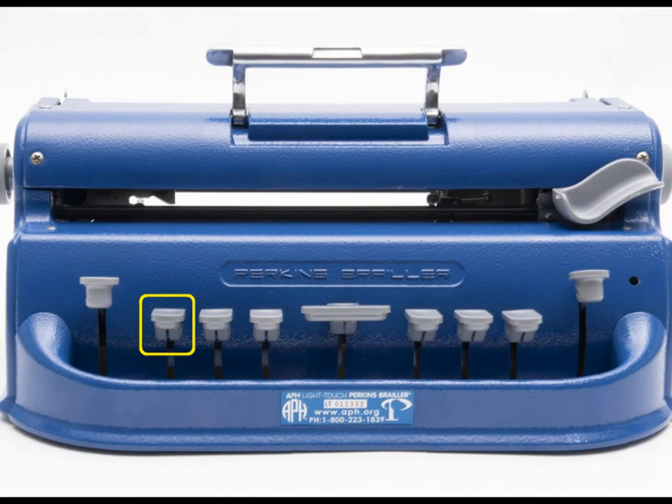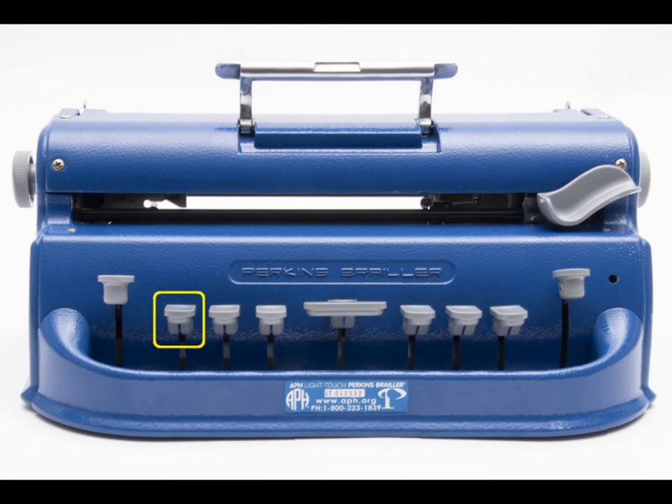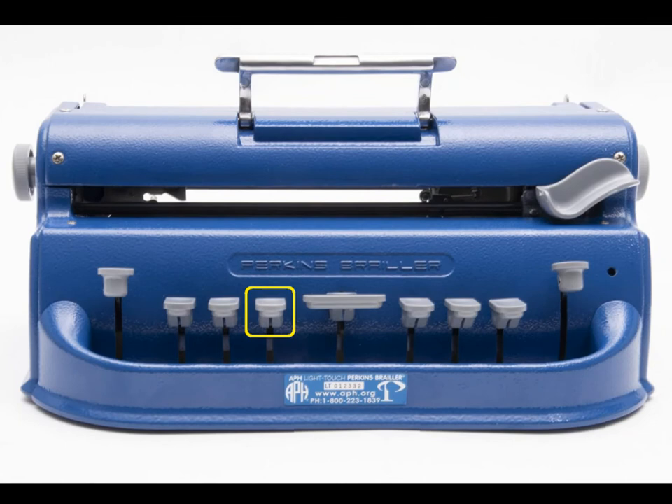The next button after that is the dot 3 key, which is responsible for the actual typing of the Braille cell. The dot 2 key is next, which has the same function as the dot 3 key. The dot 1 key is immediately next to the dot 2 key, and together the three of these keys form the left side of the Braille cell.